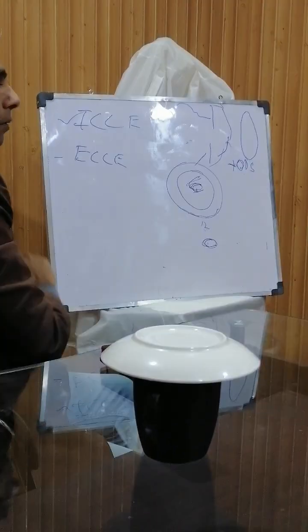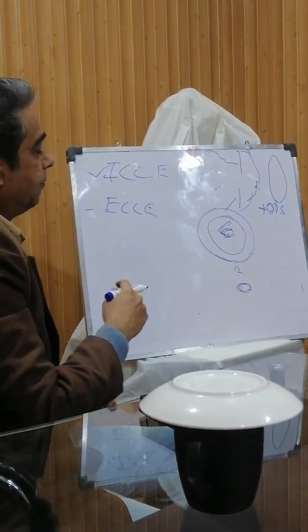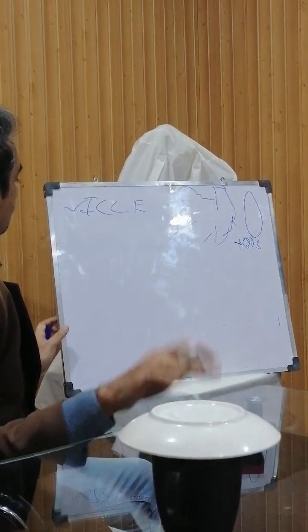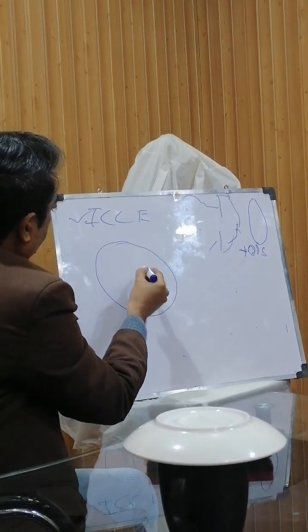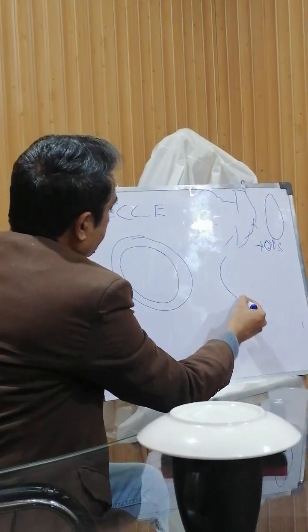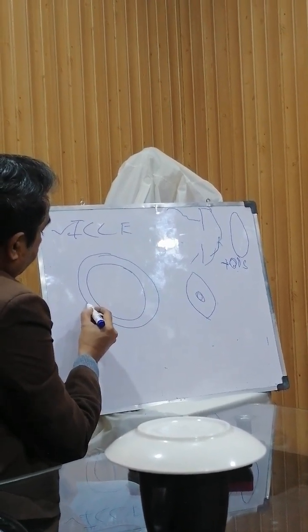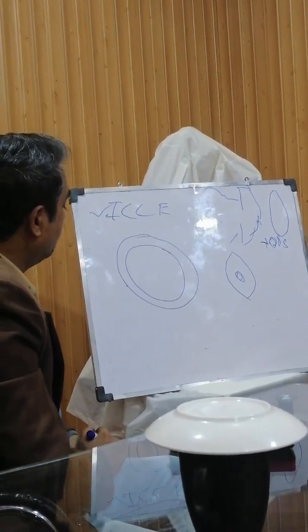Now what is the extracapsular cataract extraction? With the passage of time, when they saw the complications of intracapsular, things changed, and they developed a technique of extracapsular cataract extraction. This is the sagittal section of the lens, and this is the nucleus. In this case, we give the incision similarly. I am telling it a little bit fast because these are routinely not done.